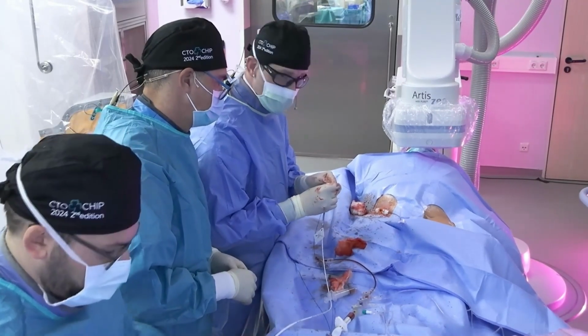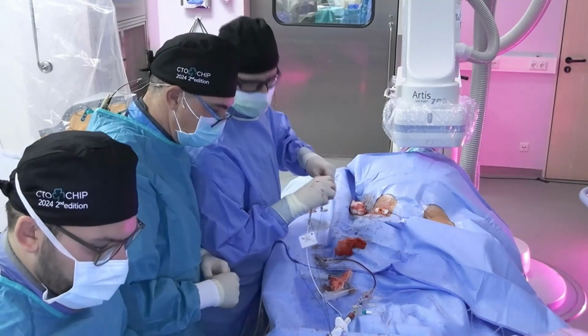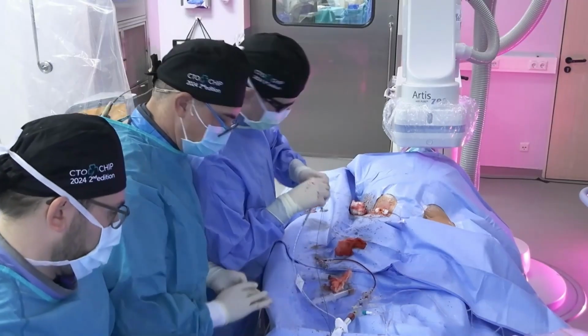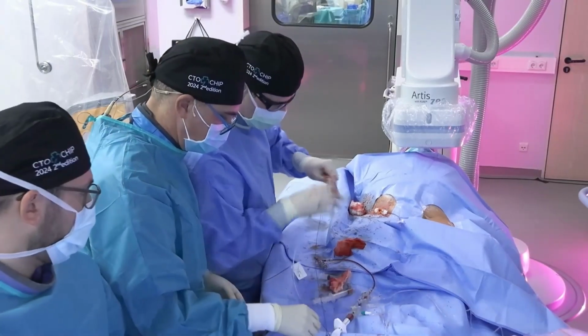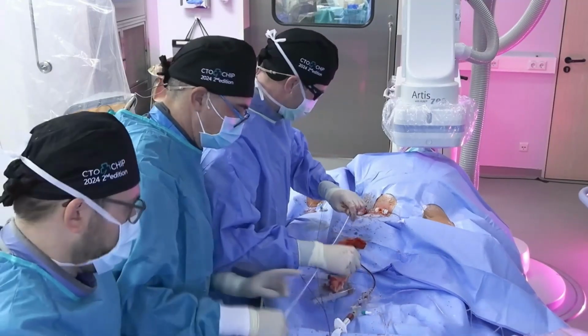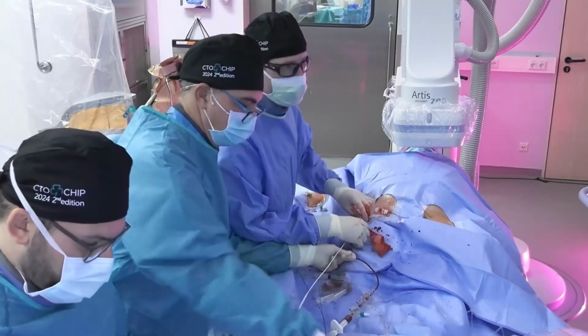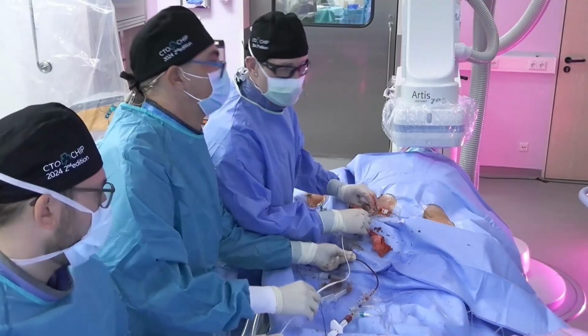Felix, this is Michael here. Hi. I think it's a very good decision to go for safety in this patient. It's a bit more of a higher technical level you want to achieve now for the procedure, but if you're familiar with it, I think it's better for the patient, of course.